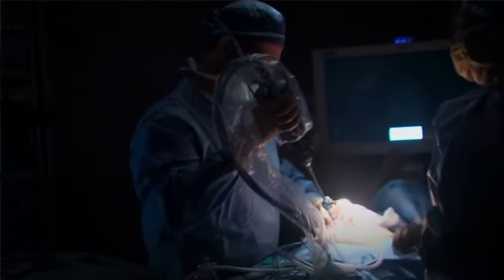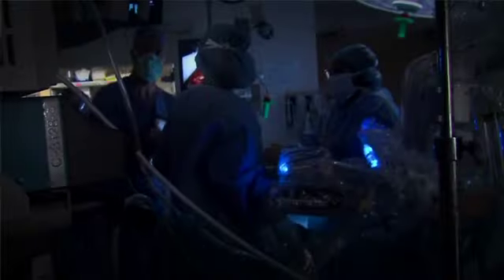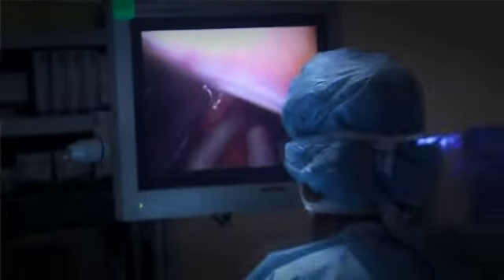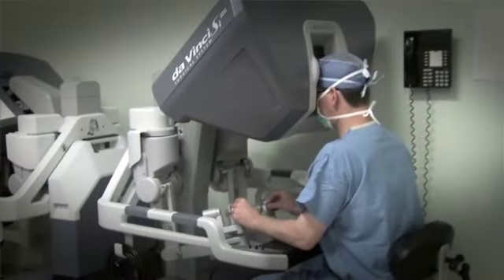The way that we're able to perform single-incision robotic surgery is that the instruments are actually flexible, which is a completely new concept compared to what we currently use. Right now we're basically using chopsticks, and you think about it, they're rigid. We are working in the confines of a single incision, and we don't have room to bend our elbows, but what we do have are instruments that are able to bend, and that allows us to not cross or collide our instruments. So they're coming around at angles so as not to collide with one another. And that's really the clever part of the robot.